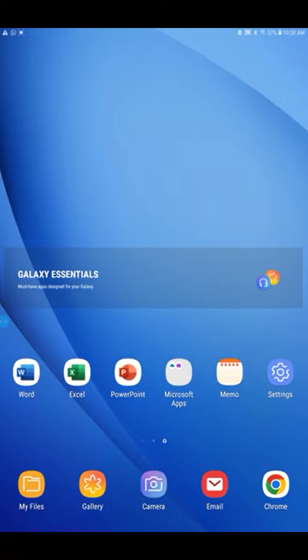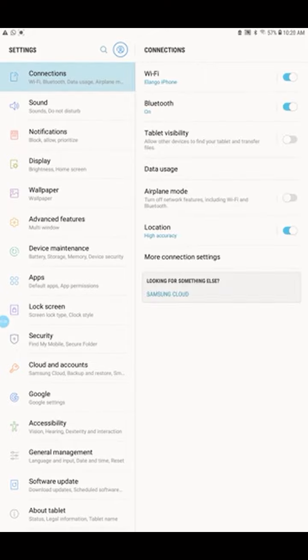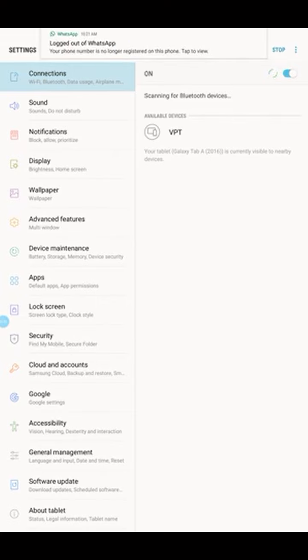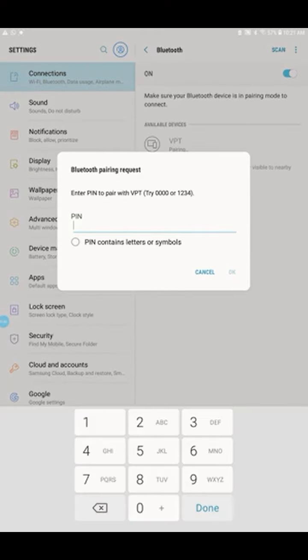setup screen, where we need to pair the device, the mobile and the vibrometer, using Bluetooth. So you go to the setup, connections, okay, then you see Bluetooth, you click Bluetooth. Okay, it is now scanning for available devices. If you are already paired, then you will get it. Since you are doing it the first time, it says available device VPT, vibration perception threshold. This is our device. You select this, then it asks for the password.